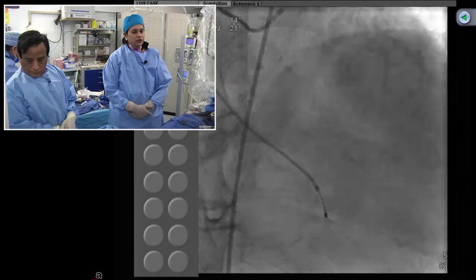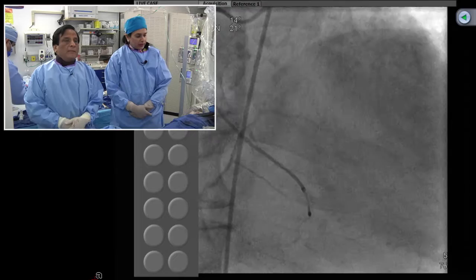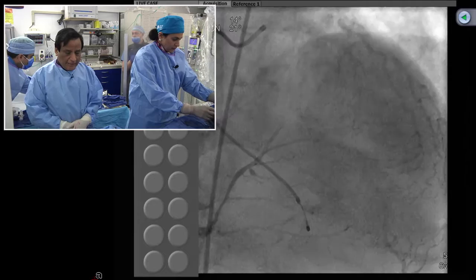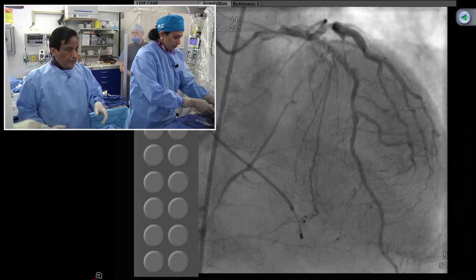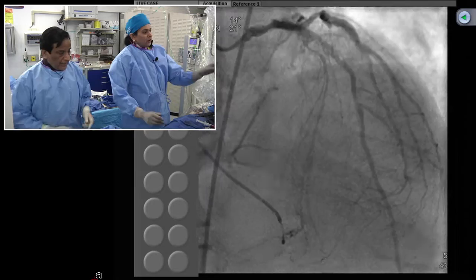When we say LV dysfunction, we are talking EF less than 30 — sometimes in the teens. In that situation, just do the valvuloplasty without pacing. Valvuloplasty is done. Now we move to the second part, which is the coronary intervention, and I will give you the latest recommendation while Dr. Keene gets ready. Knowing it is a very calcific vessel, we will use the rotablator.